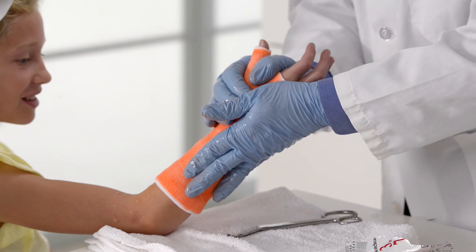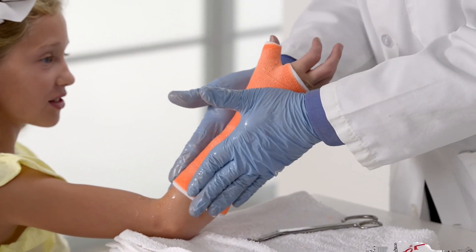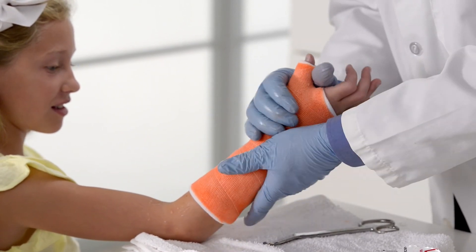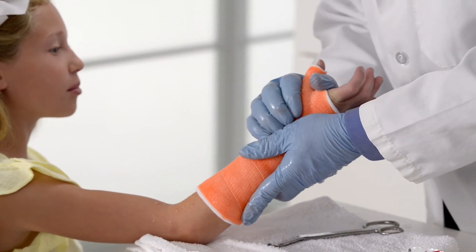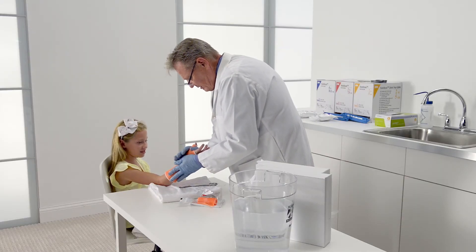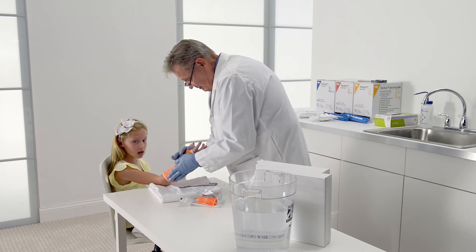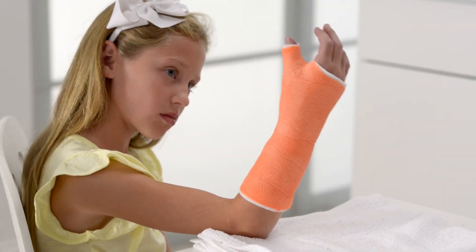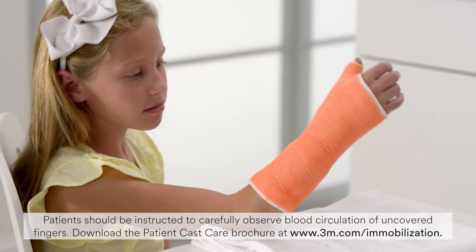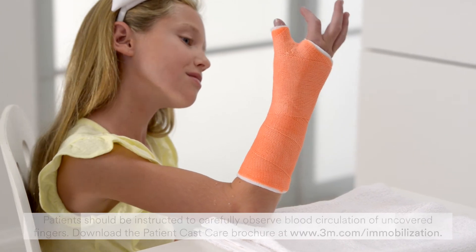Place the flats of your hands on the medial and lateral aspects of the forearm and apply gentle pressure to achieve a mold that blocks rotation of the forearm. Mold the palm of the cast by holding the patient's thumb between your thumb and forefinger and pressing the ball of your hand into the palm of the cast. With the opposite hand, continue rubbing the cast until the material has set. The cast will set within 3 to 5 minutes and will be fully cured within 20 to 30 minutes.